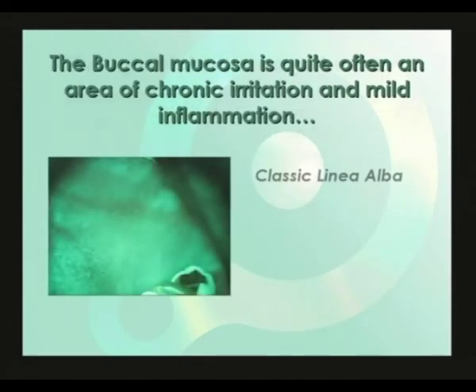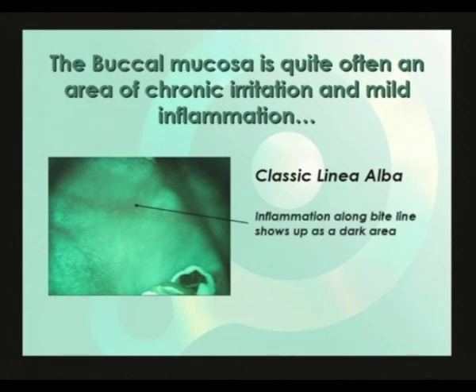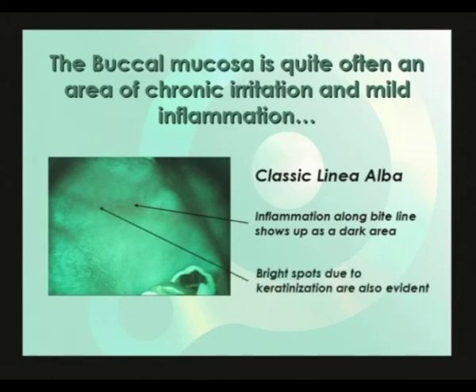The buccal mucosa is quite often an area of chronic irritation and mild inflammation. Here we see a fairly classic presentation of linea alba under VELscope. Under white light you can often see a white line corresponding to keratinized tissue right along the bite line. This can sometimes show up as a bright line under VELscope due to keratin fluorescence, but more typically appears with the associated mild inflammation dominating, showing the area as predominantly dark. Keratin fluorescence can be seen as bright spots along the bite line. Notice the diffuse borders of the inflamed region as it fades into the brighter green of the rest of the buccal mucosa.